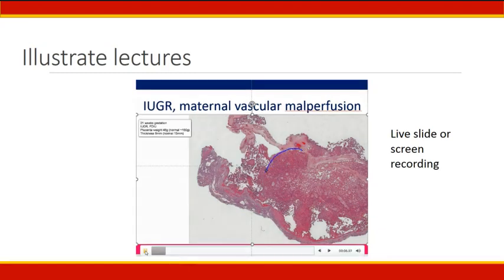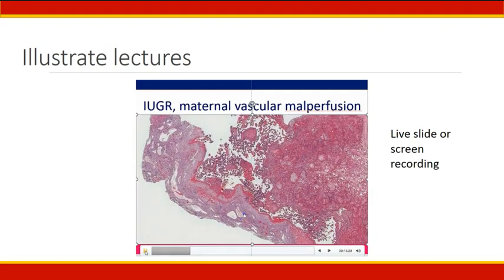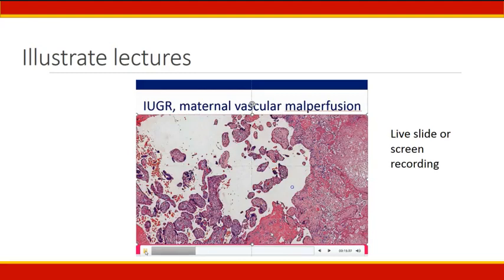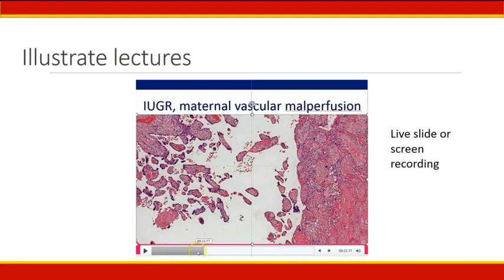In everyday life, what's best for learning histology? Looking at still photos? No, we look down the multi-header together and discuss what we see. You can create a virtual multi-header experience by demonstrating on the live link to virtual slides, where you can address questions from the audience by navigating to the exact area in the slide. Or if the internet connection is uncertain in your lecture venue, then you can create a virtual multi-header experience on a screen recording, such as this example.